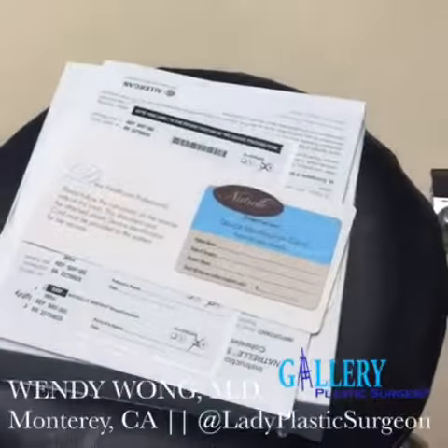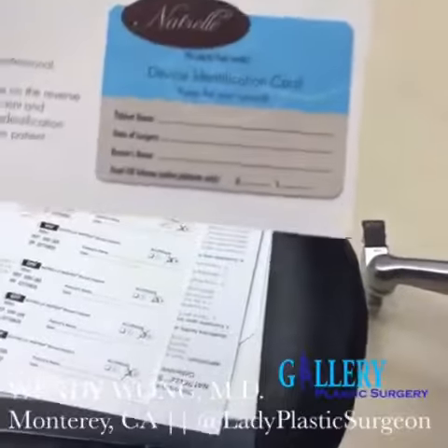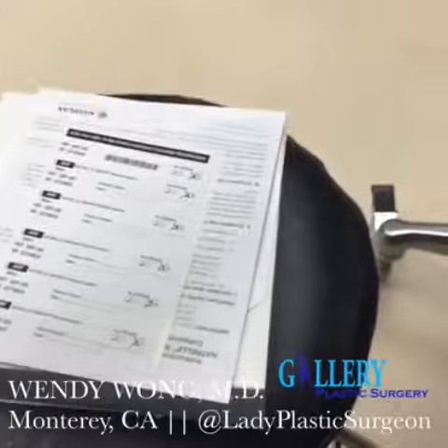This is not a cookie-cutter surgery by any means. You can see here it comes with an implant card, and you want to make sure that you do have your implant card. Keep it somewhere in your medical files — it's important to have.